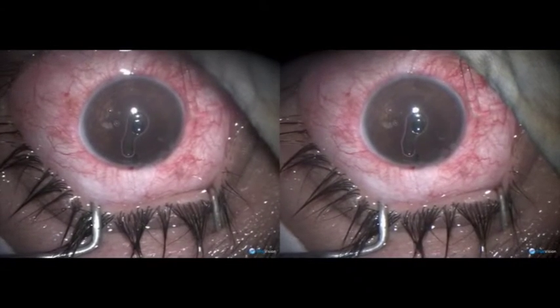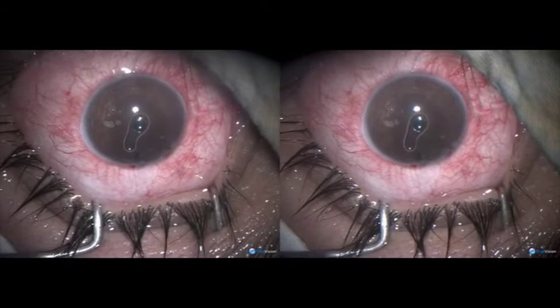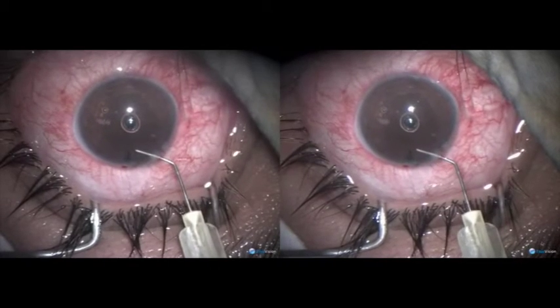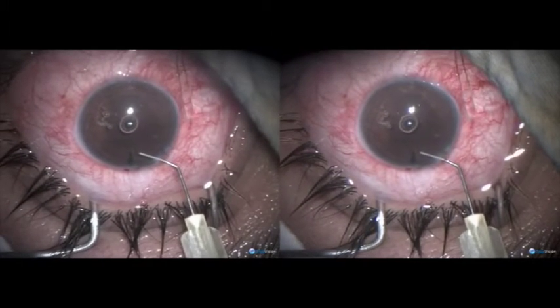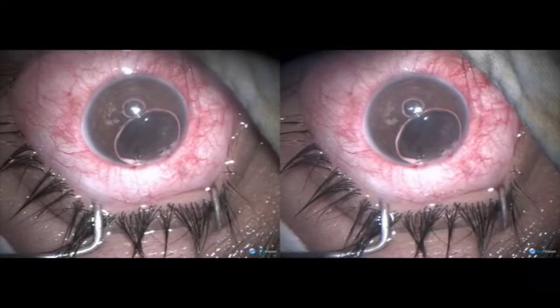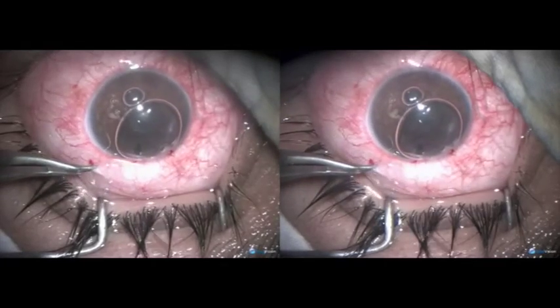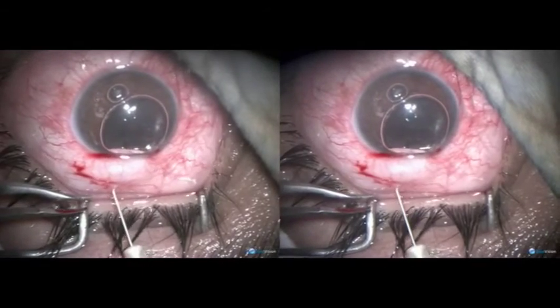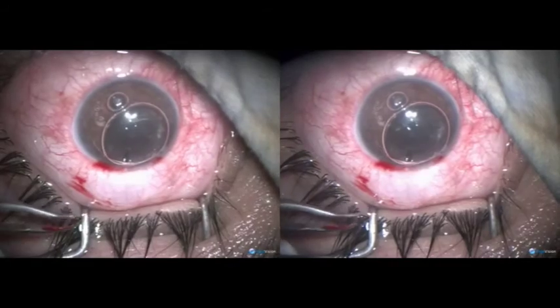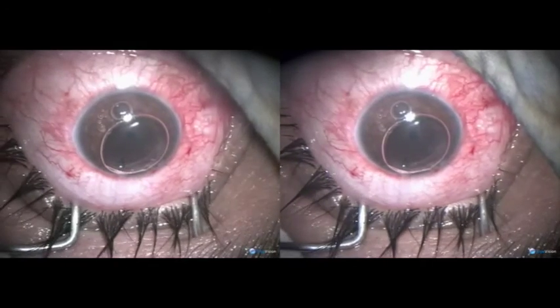When sufficiently removed, you put air in the anterior chamber. The peculiarity of this surgery is that we have made two converging tracts, and we have done iridectomy through just a one millimeter incision. The conjunctival holes are far away, so there is no need for sutures to the conjunctiva. We inject mitomycin 2 milligram in 4 ml of saline. The surgery is complete.